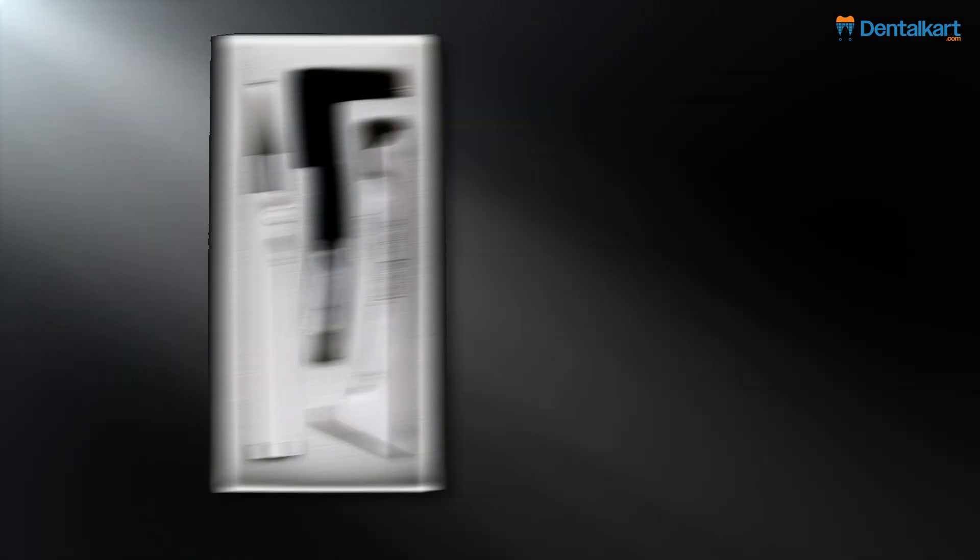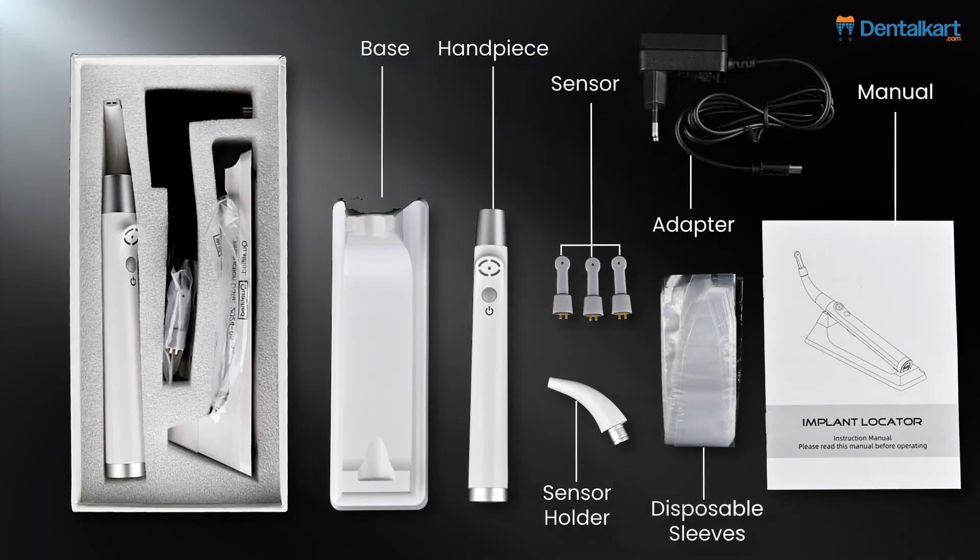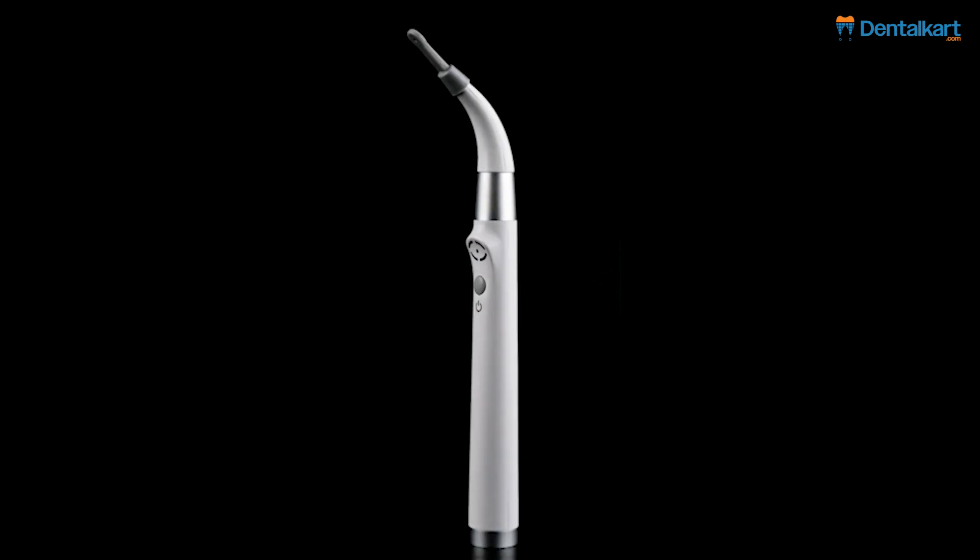Let's see what is inside the box. Let's examine its features.